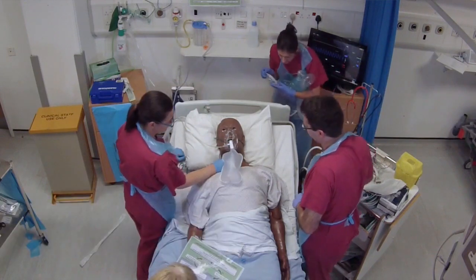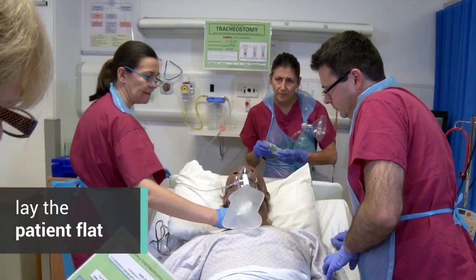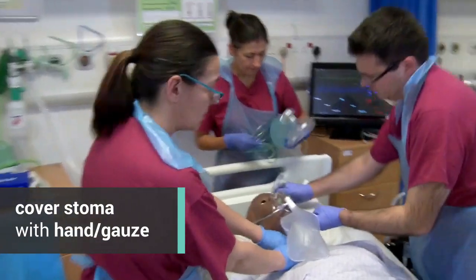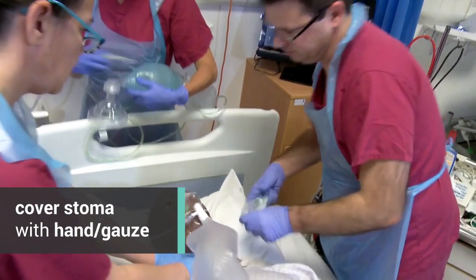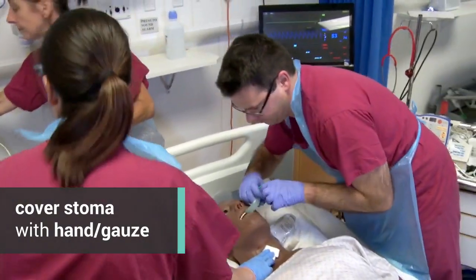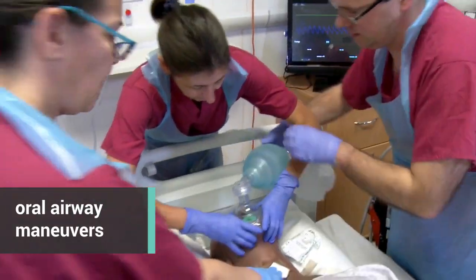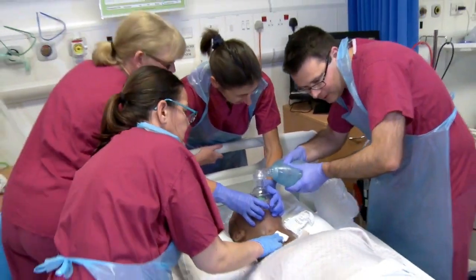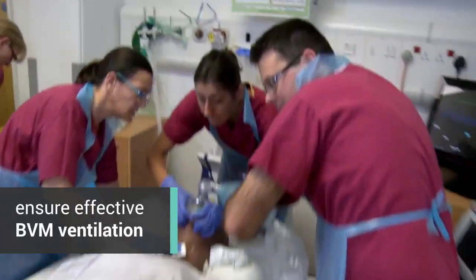We need some standard oral airway manoeuvres now. Is the stoma still covered? Yes, I've got my two fingers on it. Can you take the head of the bed away for us, Catherine, please? That might make it easier. Mind your backs there, everybody. All right, we're ventilating.